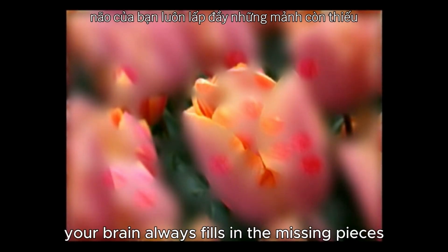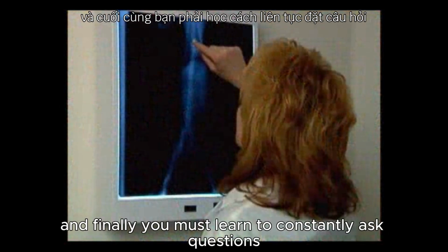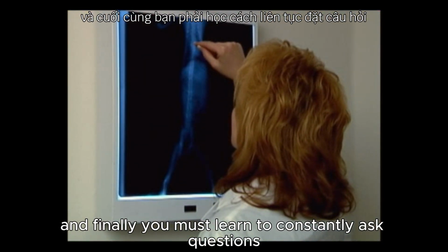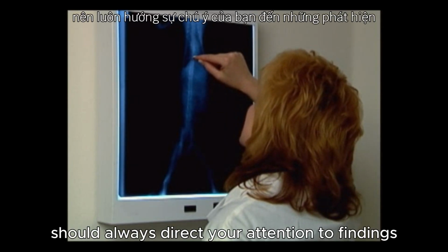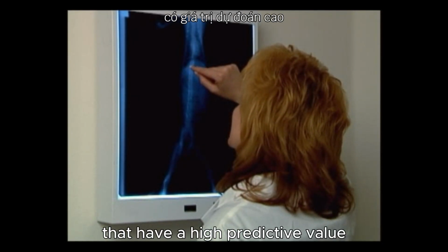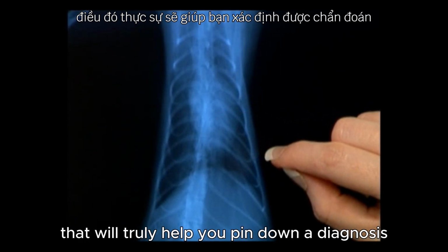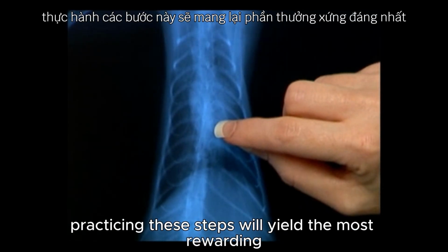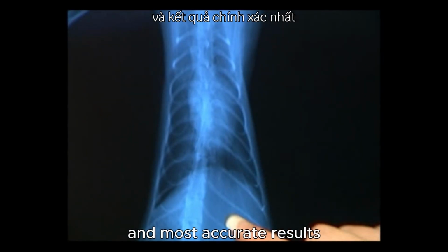Remember, your brain always fills in the missing pieces by reconstructing an image based on prior experiences. And finally, you must learn to constantly ask questions while examining radiographs. These questions should always direct your attention to findings that will result in conclusions that have a high predictive value. This keeps your attention focused on those areas that will truly help you pin down a diagnosis. Practicing these steps will yield the most rewarding and most accurate results.